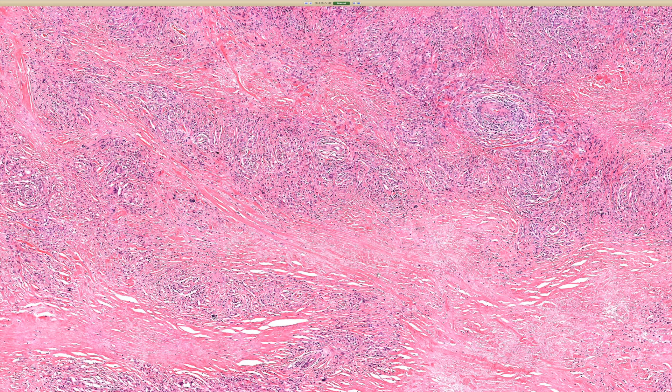We see this pattern in granuloma annulare, in rheumatoid nodule, in necrobiosis lipoidica diabeticorum, and in this entity NXG, or necrobiotic xanthogranuloma.